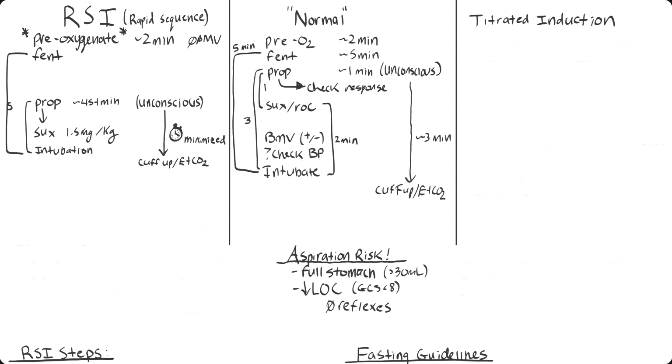And the timing that works out here is that by the time you're fasciculating, you will have a reasonable level of unconsciousness, but the timing here is very, very tight. And then you can intubate after you fasciculate. The entire timeline here we're looking at is about 45 seconds from unconsciousness to the tube in, and with your protected airway. So you'll insert the tube, you'll inflate the cuff to protect the airway and check for placement.